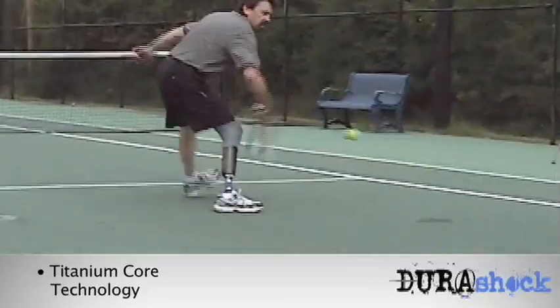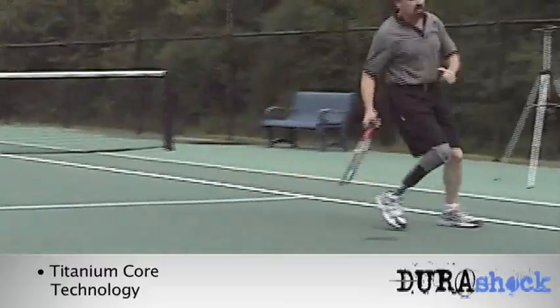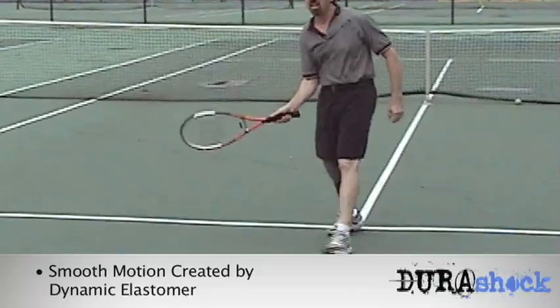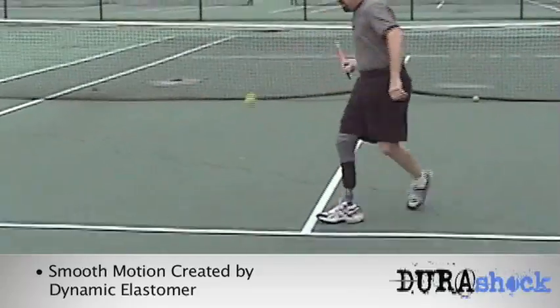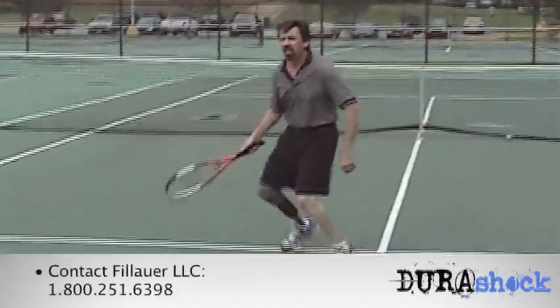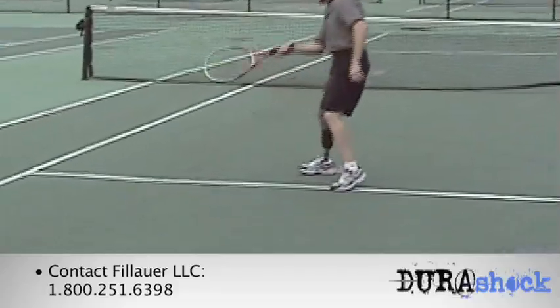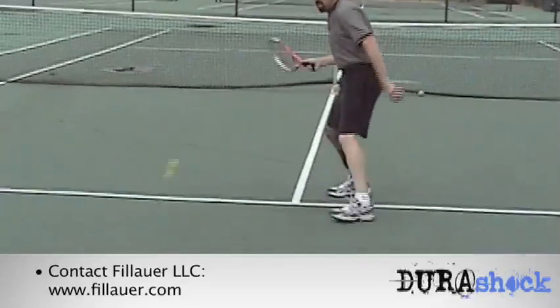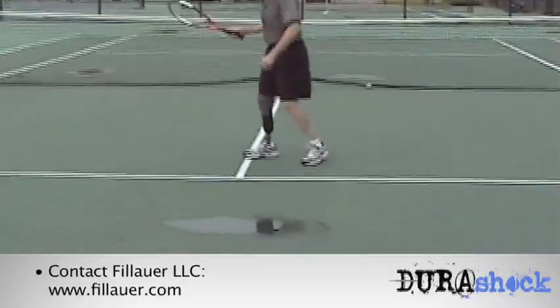Which can cause the skin to break down. The DuraShock makes everyday activities a lot easier because of the rotation and the shock absorption that it has — things like playing sports, going for a walk, or maybe working in the yard. The rotation and the shock absorption really work with you and with your prosthesis.